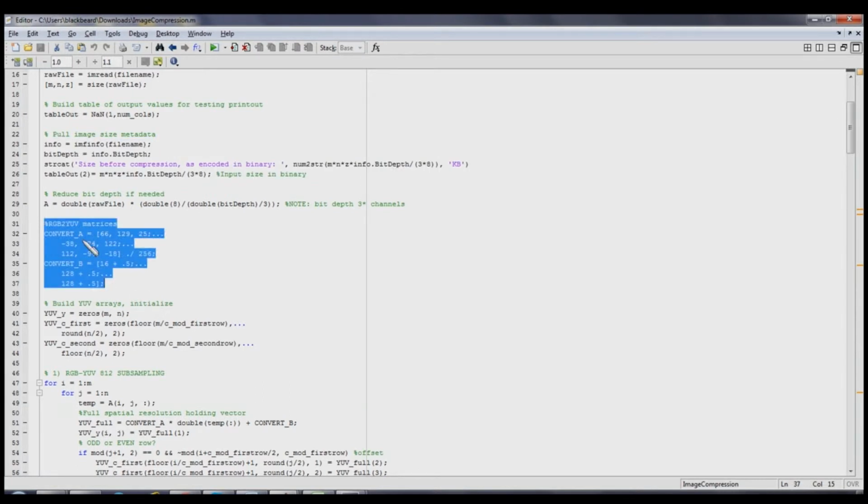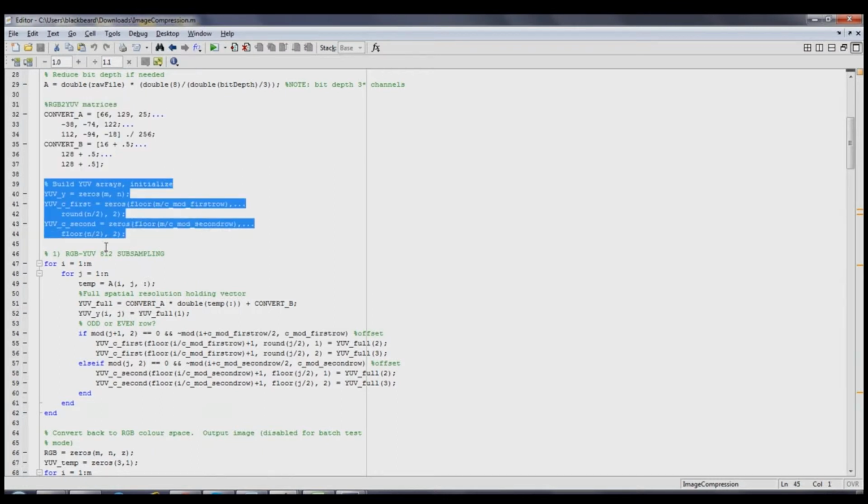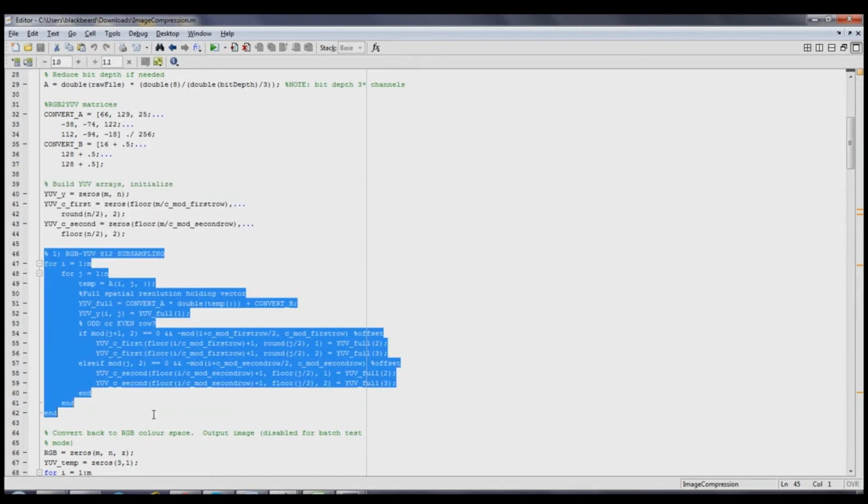As per the formula defined in Khan's paper, we build a matrix for scaling and a vector for shifting to convert from RGB to YUV color spaces. Next, since the output spatial resolution differs for the Y channel, odd row C, and even row C, we required 3 separate matrices, which was a little bit difficult to code. Next, sample pixels are fed into the YUV color space matrices.